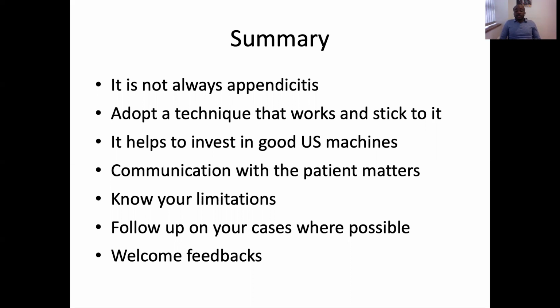We also should adopt the technique that works and stick to it. So read up some ultrasound textbooks, bowel ultrasound textbooks, see how other experts do their bowel ultrasound, and just follow a technique that works for you. Like I explained earlier, it's important to mow the lawn, and then follow the large bowel from the sigmoid colon all the way back. That way you'd easily rule out ulcerative colitis. First, when you get to the terminal ileum, you're easily ruling out Crohn's disease, and you can easily check the appendix in the right iliac fossa, and then you can mow the lawn to check the rest of the small bowel. So your technique matters a lot.